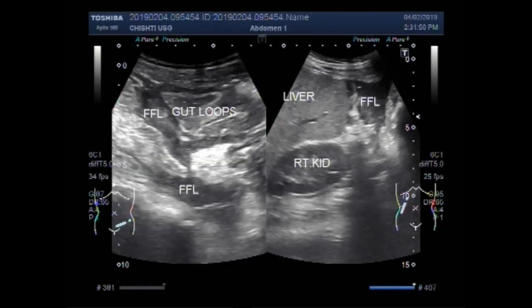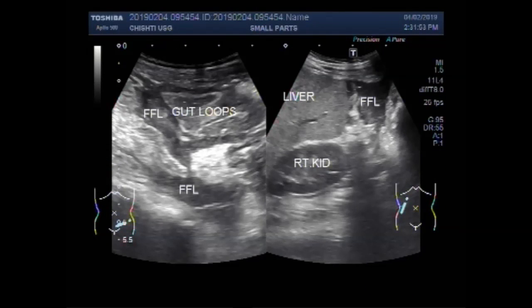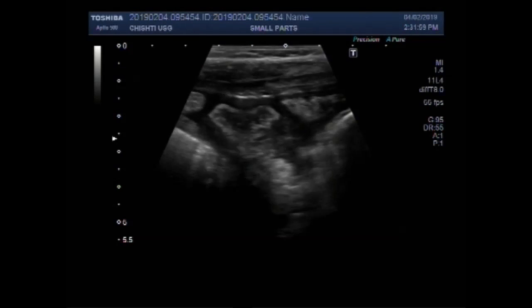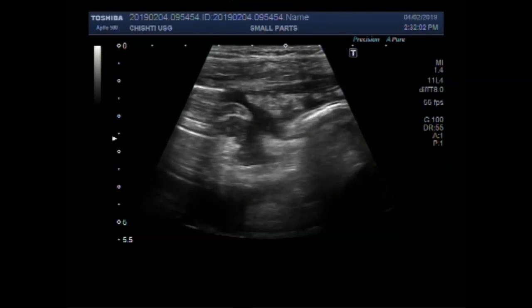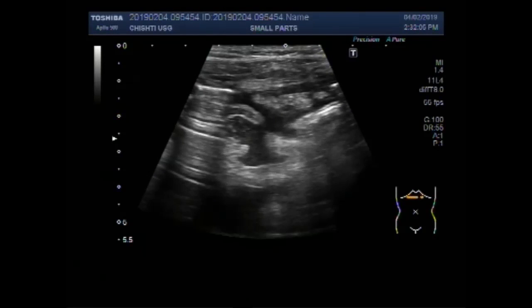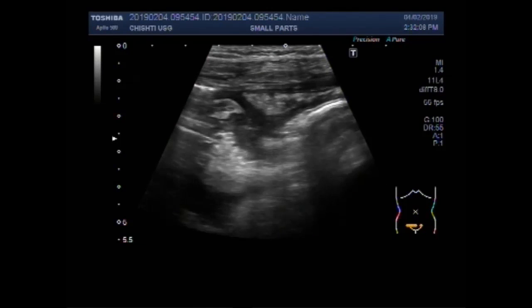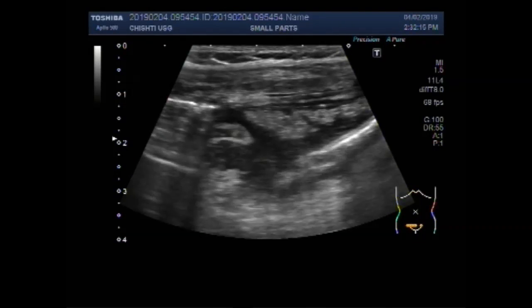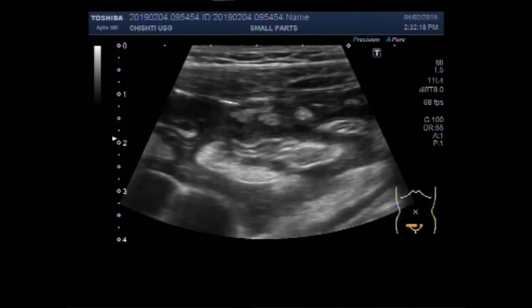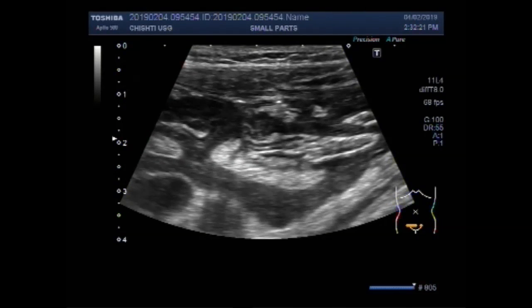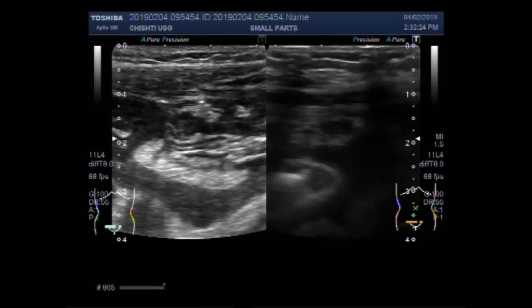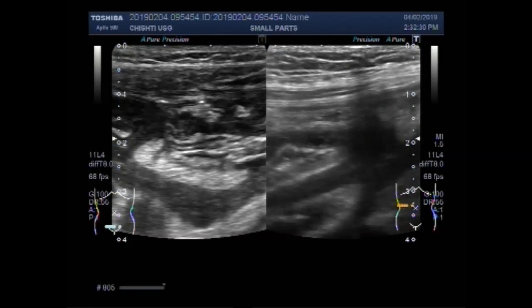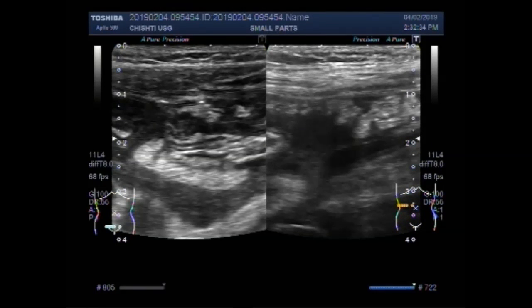Now you are going to see the examination conducted by a high-power linear probe, 7 to 11 MHz frequency. Now you can see the gut loops with no intestinal motility. You can see the lumen of the gut loops is narrowed due to the inflammation of the gut walls. You can see the free fluid.